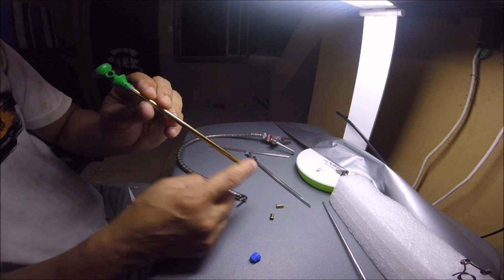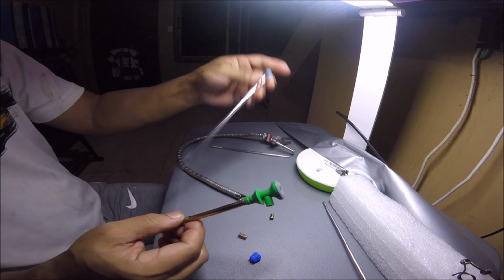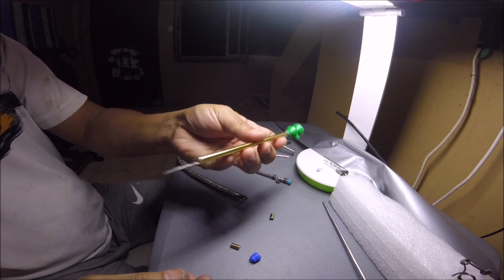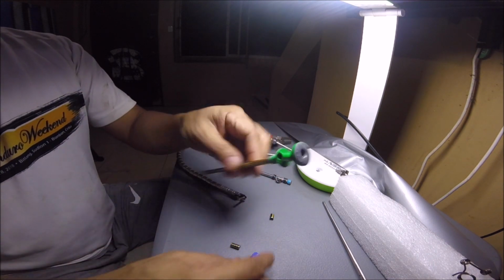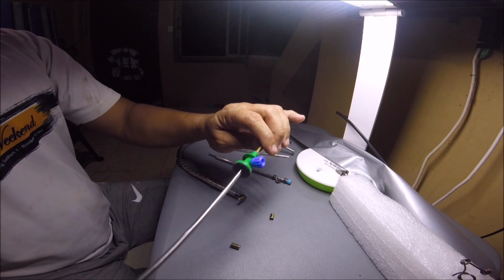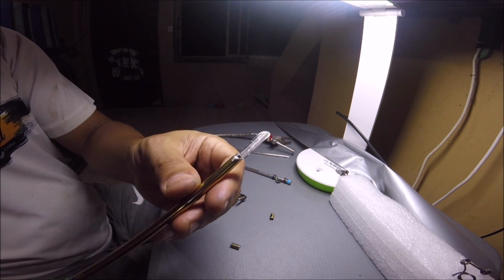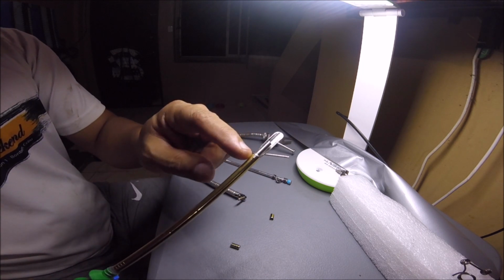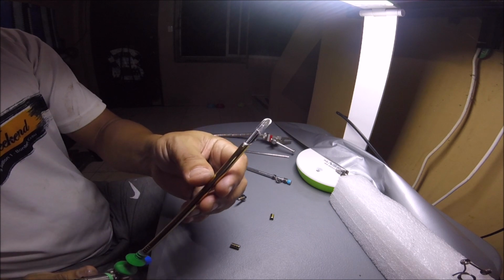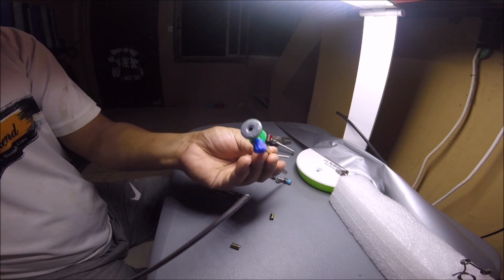And also this basically marks where the retractor blade is, so I know how this is facing at any given point in time. All I have to do is build the holder pretty much like that holder, and build it around here so that the Layla can hold on to it. And that's my retractor blade. Okay, so that's new and improved. So this works just like the obturator, the cannula of a regular arthroscope, except that it has a retractor blade over there, which the normal obturator doesn't have. Normal obturators will only go up to here, and that's it. It's just an outer sleeve and the water delivery system. So this is triple purpose. It's an outer sleeve, it's a water delivery system, and it's a retractor at the same time. Okay, so it's a much more versatile version.